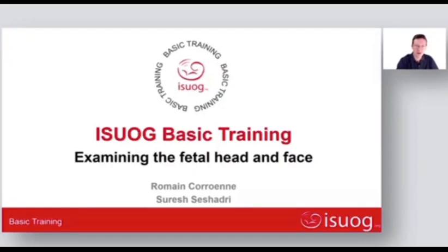I'm a specialist, and today we will be reviewing how to scan a fetal head. The first part will be theoretical, and during the second part, Dr. Suresh will perform a live demonstration.